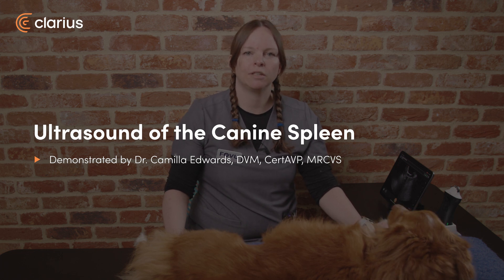Hi, I'm Dr. Camilla Edwards from First Opinion Veterinary Ultrasound, and today we'll be looking at how to scan the spleen of a dog.